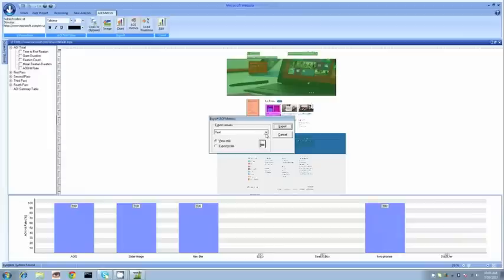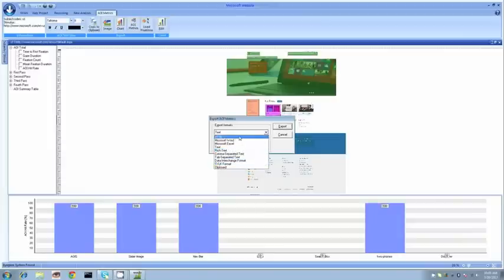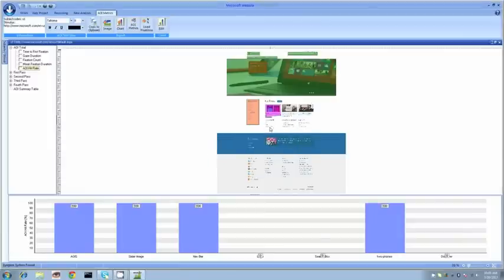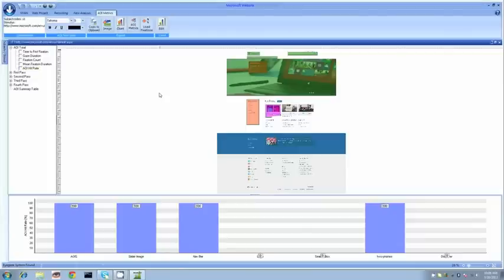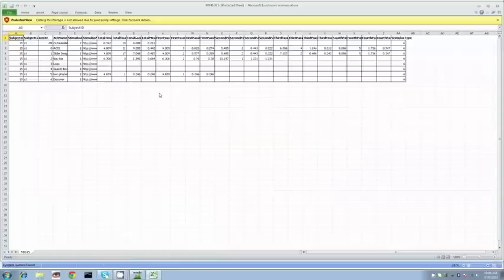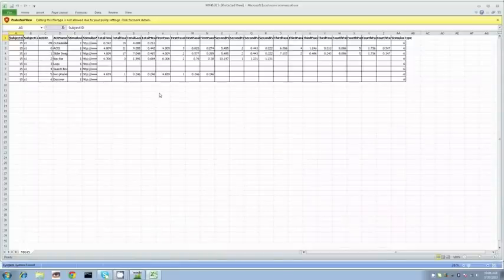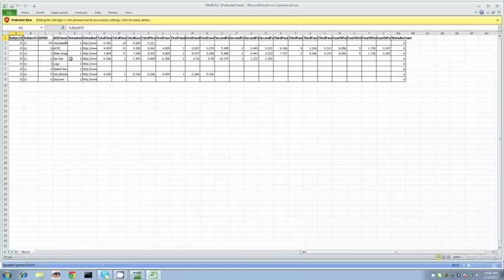Of course we can export all this data. We can put it in all these various formats. We'll put it into Excel really quickly. This quick chart is going to show you each individual area of interest and the related gaze data in milliseconds in relation to that.